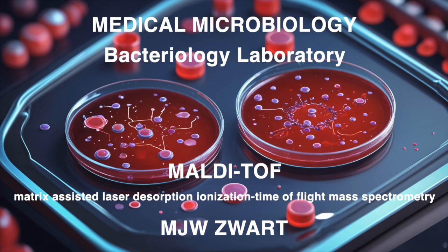Okay. Last but not least, we've got saponin at a 5% concentration. Now, the document says it's used specifically for preparing samples from BACTEC blood culture bottles. What's its role? Saponin helps to lyse, or break down, the red blood cells in those bottles. This basically concentrates the bacteria and makes it easier for the Microflex to detect their protein profiles. So it's like clearing away the clutter to get a better look at the bacteria that are in there. Exactly. It's all about getting the best possible signal.